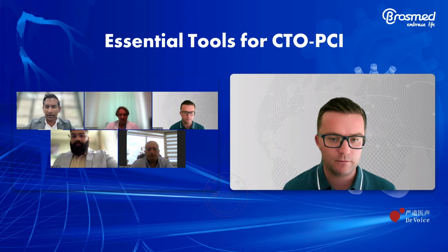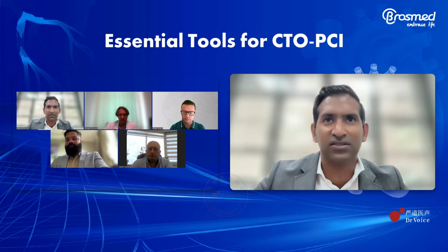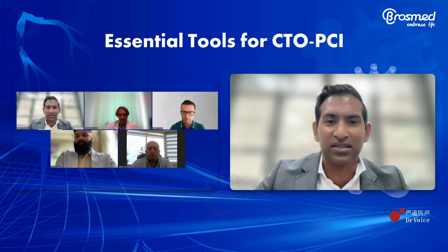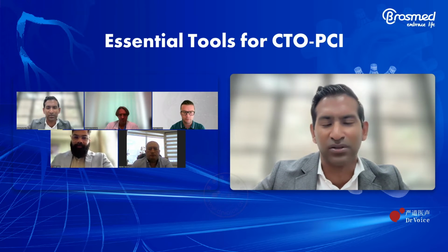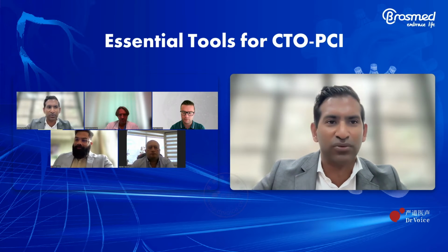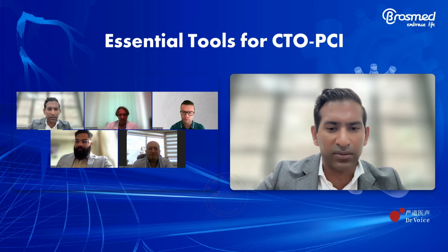Yeah, totally agree. I think that one of the things that's been a great addition is the elongated catheters, the ones that are 162 centimeters, 170, as you say, to not need to use a shorter guide from the retrograde approach. So that's definitely a great addition to the more recent microcatheters. Okay, great. I think we'll move on as we're just starting to go behind time.